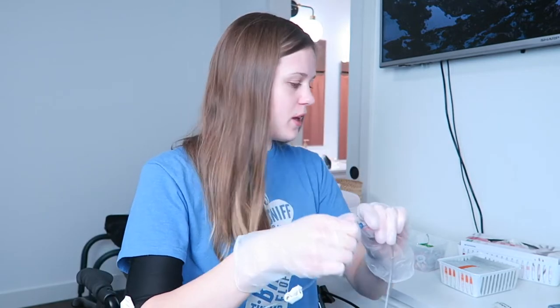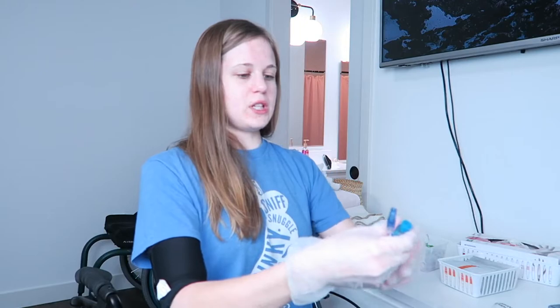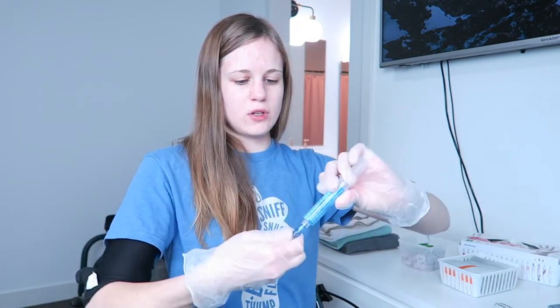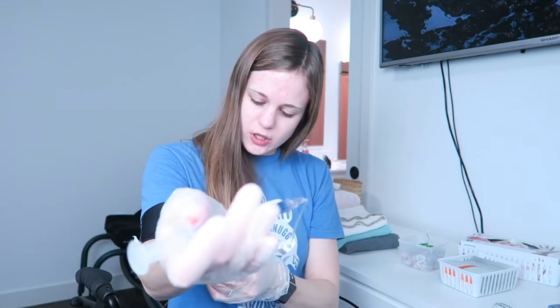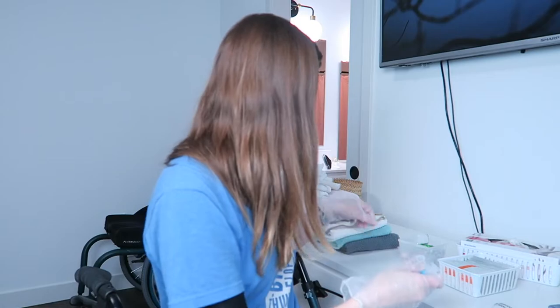Take the tubing off of the clave connector. Then take your heparin, stick it on the end, twist. Make sure your clamps are open. And then push, pause, push, pause, push, pause, push, pause. That just helps break up any blood clots if they're starting to form. And heparin is an anti-clotting medication, so push it all in, just like that.